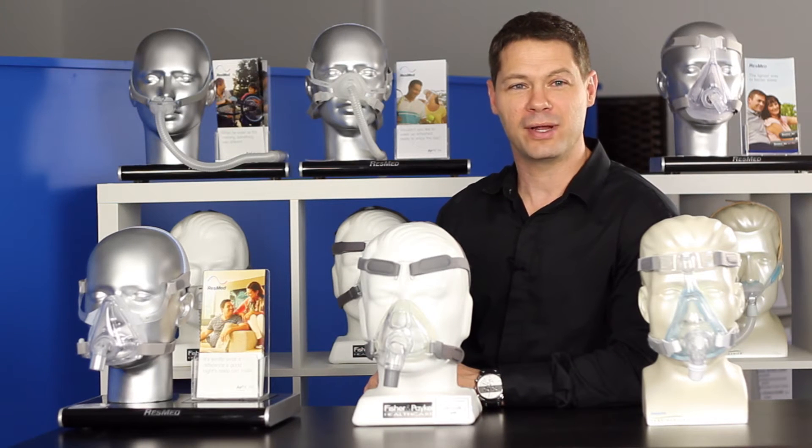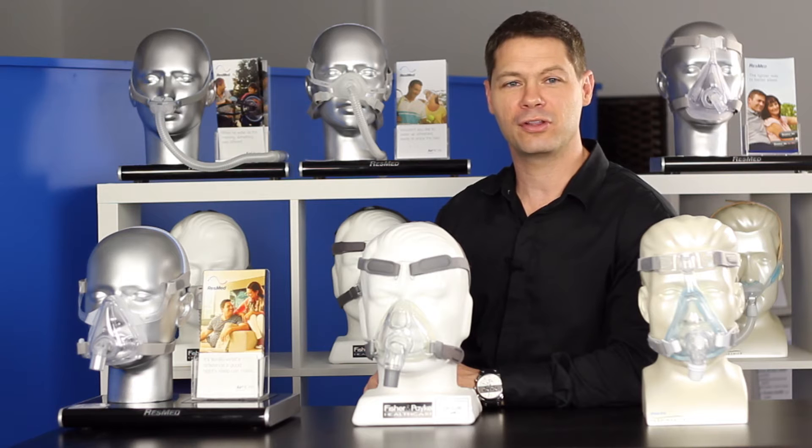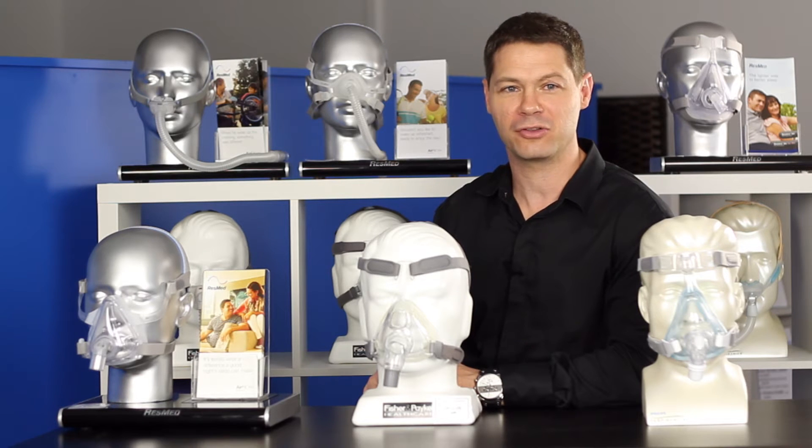Hi, I'm Bryce from CPAP Direct. In this video, I'm going to show you the three most popular full face masks on the market.